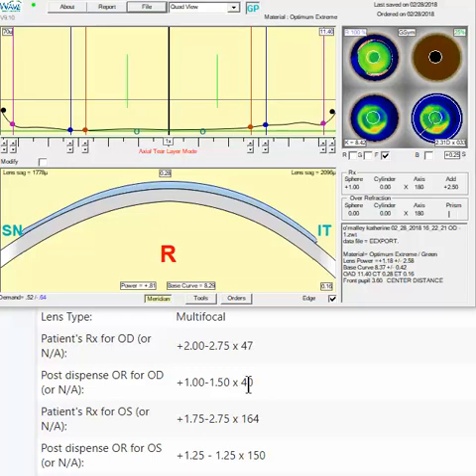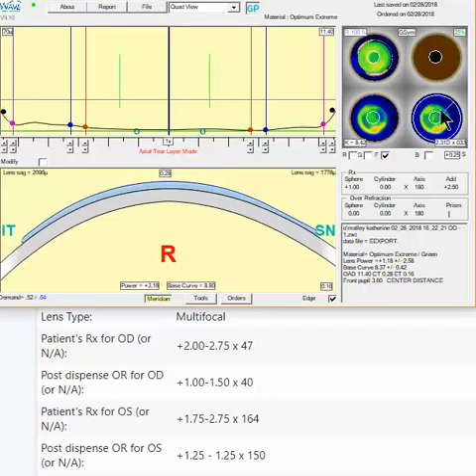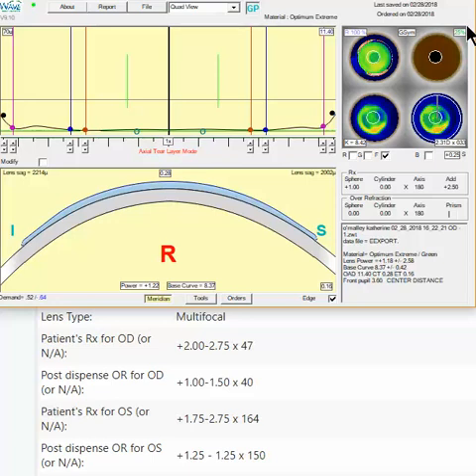As far as the lens design, if you want to change a certain meridian, going back to your basic lens fitting techniques, if you click on your quadrant control up in the right hand corner of the upper quad view, you'll see you have 100% as an option, 25%, and 50%. So in this case, if you want to change the one quadrant, go down to 25%.